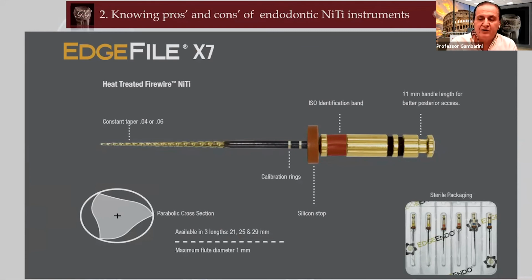And the reason why is because of their properties. So if you increase the speed, you make them a little bit more effective in cutting. But you don't need to increase the torque in this case because they still are low torque instruments. And in the same way, if you increase the torque, that doesn't make a lot of difference because they already work very nicely with a low torque.